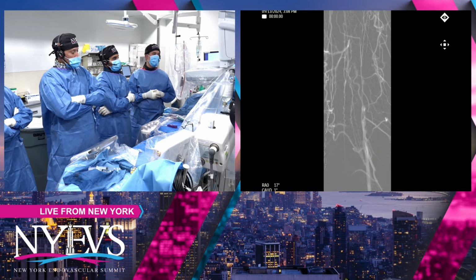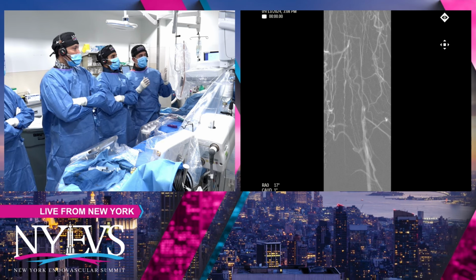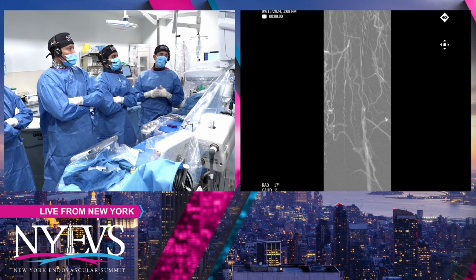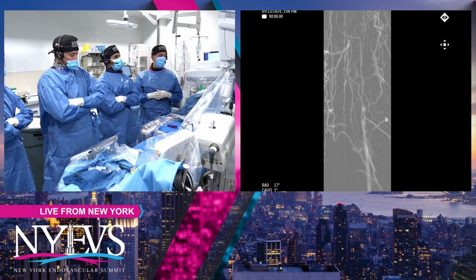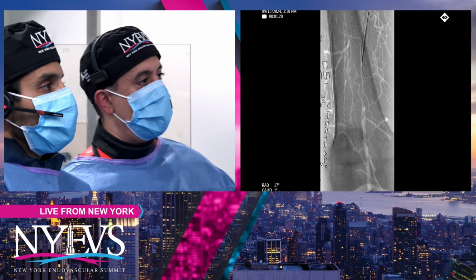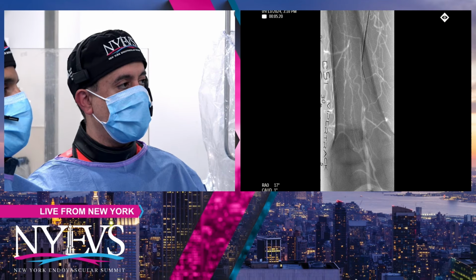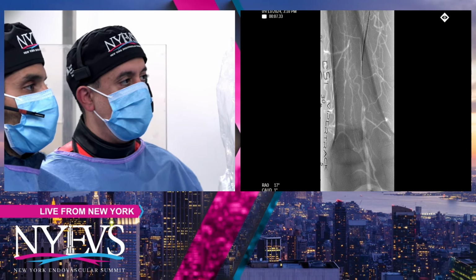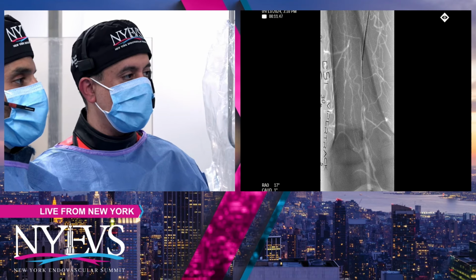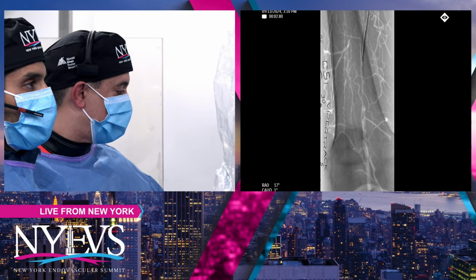But then what started to happen was, while Raman was trying to wire, it was just going into the false lumen just after the stent, so he decided to change to an 018 wire system to try to find the lumen. So we used an 018 stiff wire, and then eventually, with some navigation, we were able to successfully cross distally into the normal distal segment, or the P1 segment, into the distal SFA right there. So after this, we've already crossed.